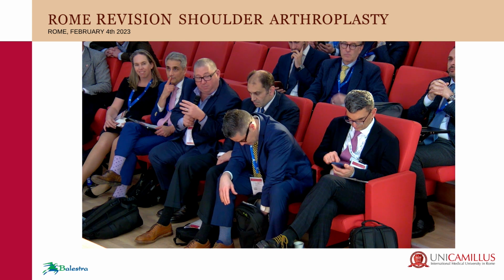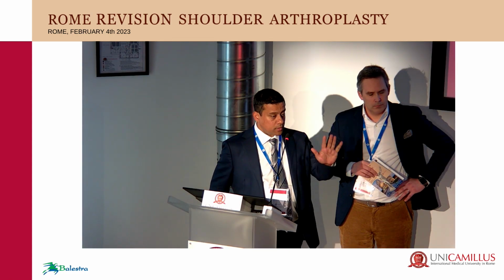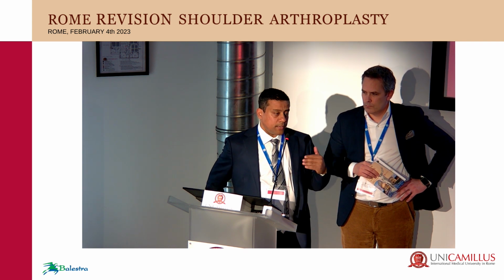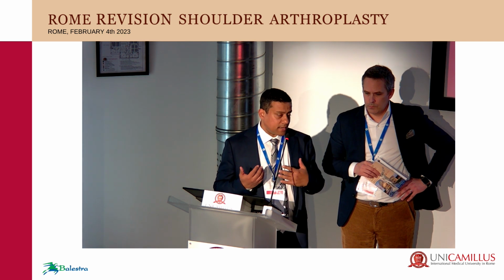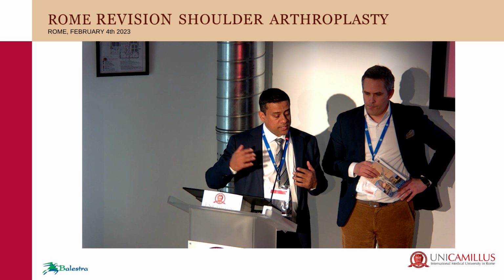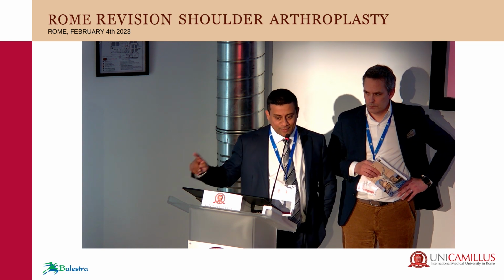Yeah. So you close the patient, but you don't close the skin all the way. I just use running nylon and close everything. I put a combine or a pack on it and put some Opsite or Betadine drape on it. Because the whole procedure takes 6 or 7 hours, for me debridement, removal, washout is 3 hours, and then the reconstruction is like 90 minutes to 2 hours. I also found that the re-prep, re-drape and the new instrumentation kit which needs to come in takes 20 minutes. So that's the only time I have a proper Coke and not a Diet Coke.